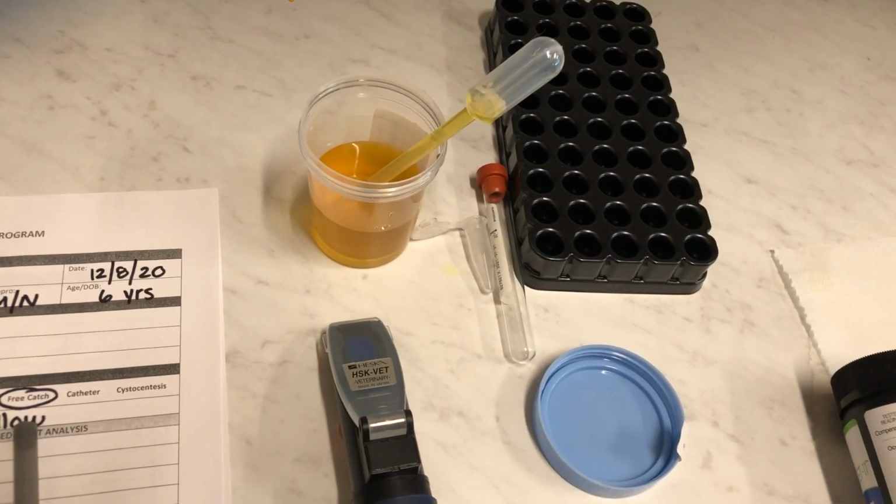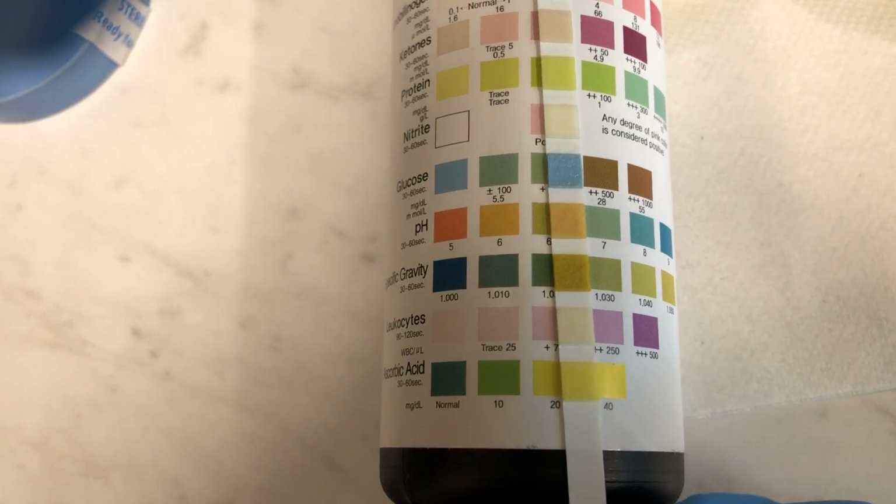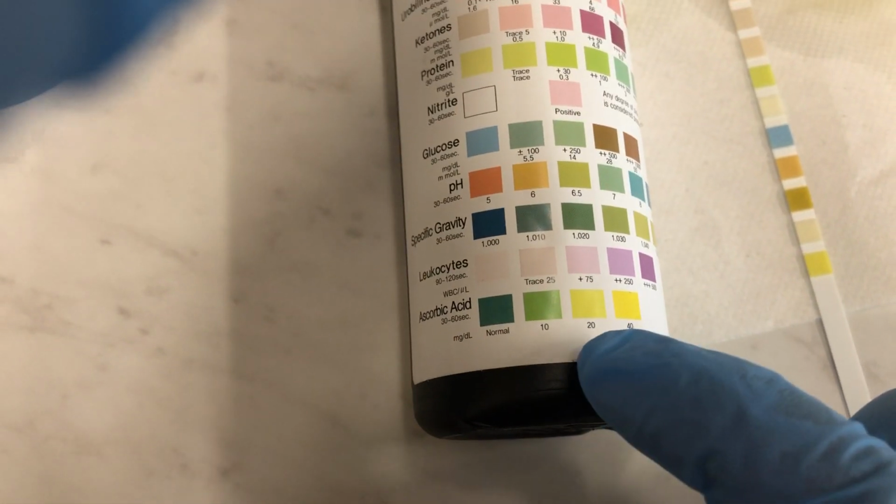What I like to do, especially if you have trouble telling colors apart, is hold my strip right up next to the bottle itself. That'll help me distinguish which color it more likely looks like. So starting at the bottom with ascorbic acid, it's yellow, but if I lay it in between these two, to me it looks more like the yellow square on the left. So that would be a value of 20.